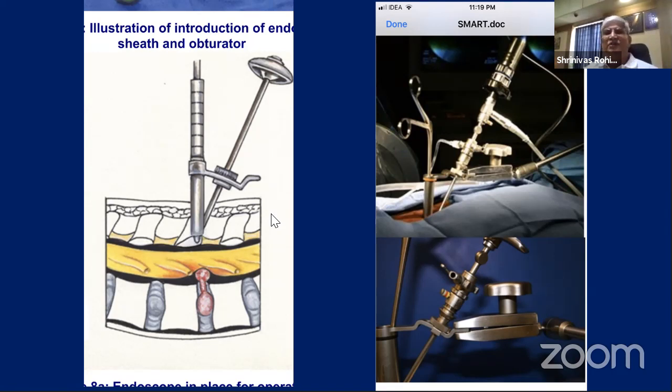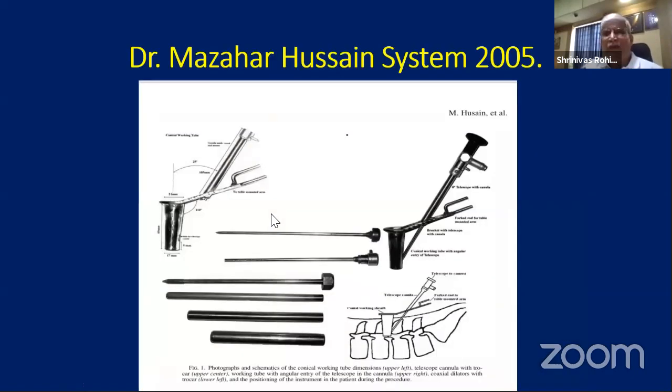The other differentiation is whether you are using fluid or air in the tubular retractor. So these are the two differences. Just remember this slide, because this was in 2002. A similar system was made by Dr. Mazhar Hussain from Lucknow, and he presented that in 2005.